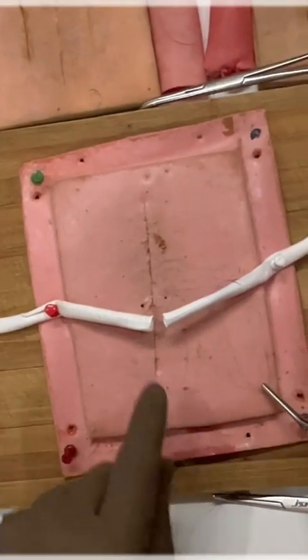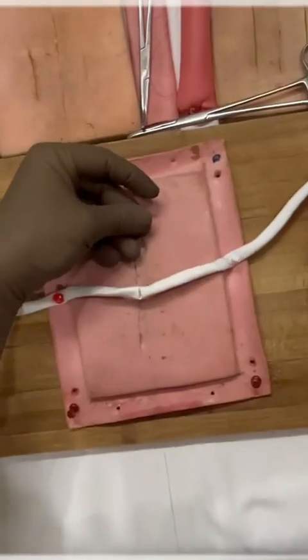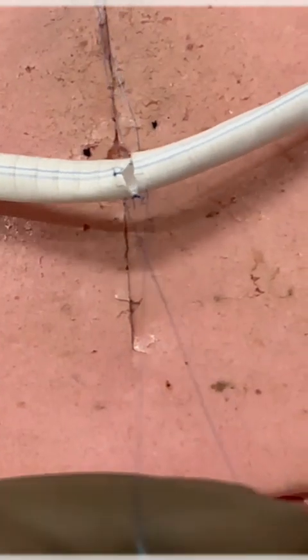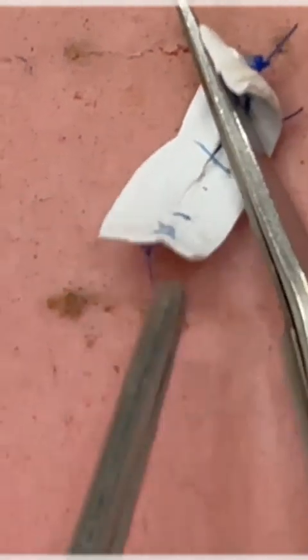So now we are bringing the farther end, that is the 12 o'clock suture, beneath the arterial wall. It rotates this way, so the 6 o'clock goes to 12 o'clock, the 12 o'clock goes to the 6 o'clock, and the posterior wall of the artery is basically exposed. In the last step, we will tie the knots. This is the anastomosis segment I have cut to demonstrate. All the knots are outside, and this will heal beautifully.